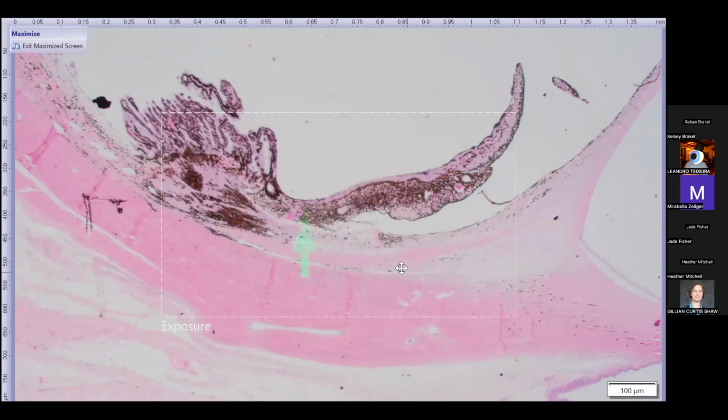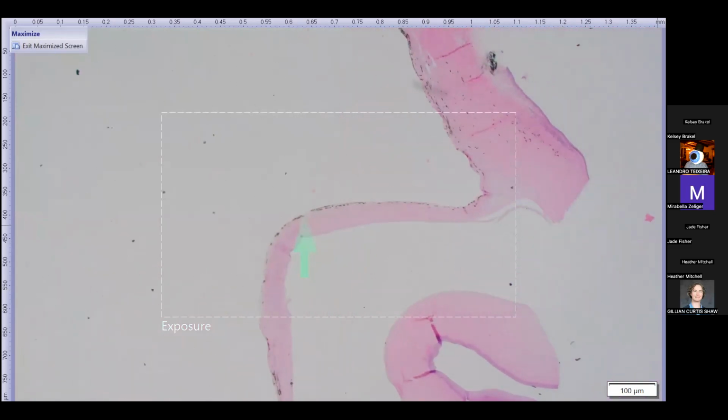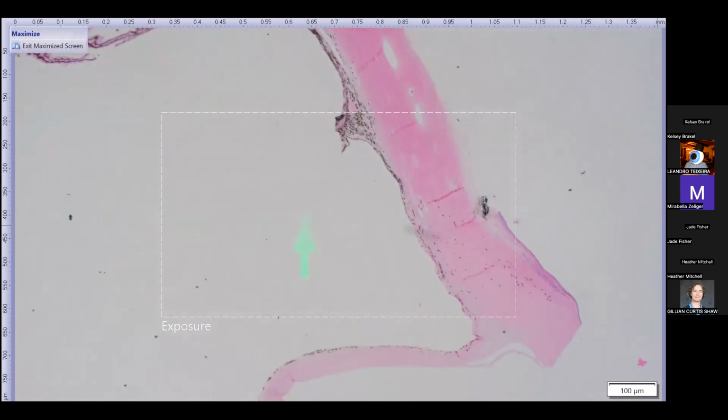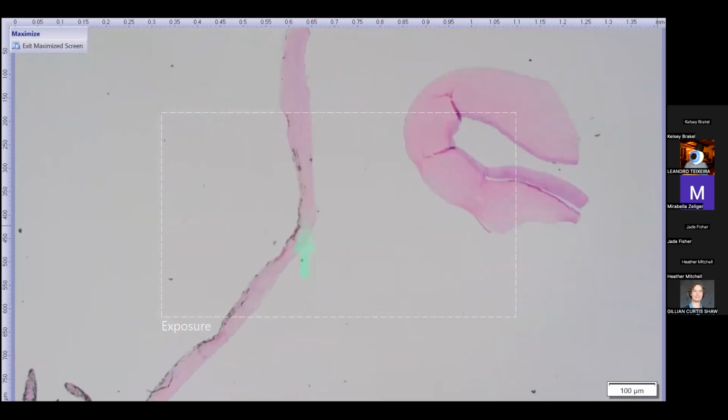Another feature is this end and that end, showing off the peripheral break of Descemet's membrane. Peripheral breaks in Descemet's membrane are pretty common with blunt ocular trauma. The force when the cornea is hit with something tends to distribute out to the periphery. We'll sometimes see those peripheral breaks in particular. So all consistent so far with the trauma in this case. And we can track that anterior chamber membrane to the other side. And the iris is sort of unclear on this side, so lots of distortion and tearing of the anterior uvea.